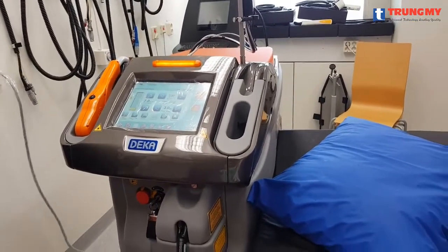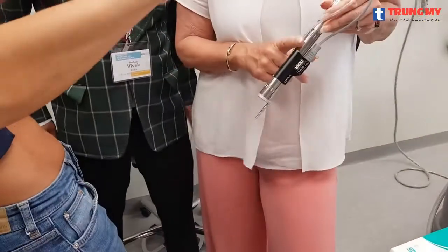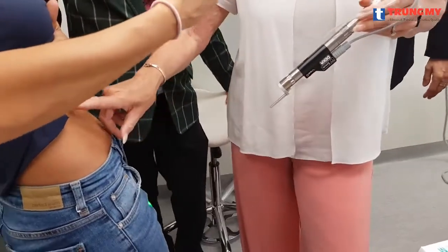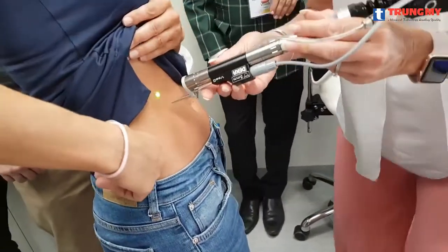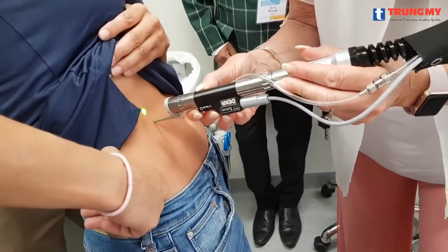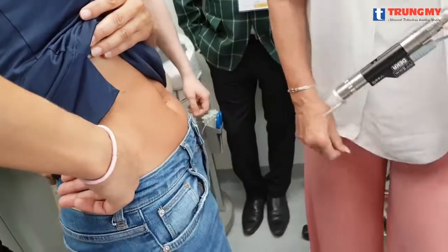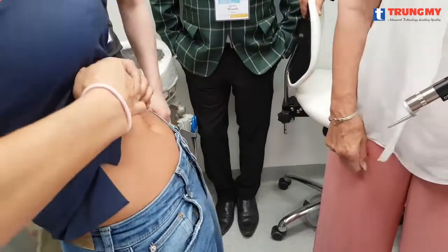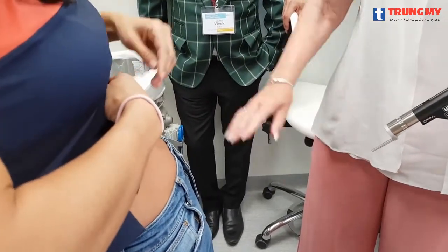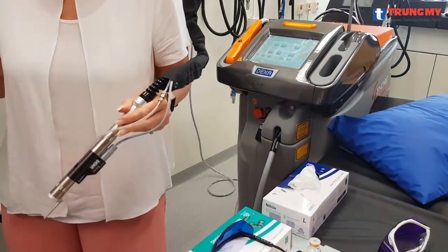Yes, a little bit. Fatima is right here. Actually, she has a little bit too dark for this wavelength. I would choose a YAG laser on this one — it is a larger one. So, we could take a YAG laser on you, Fatima, because we will get rid of some pigment. It will come back, though. It will come back.